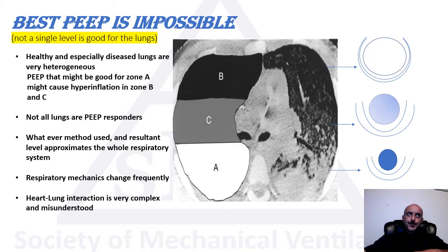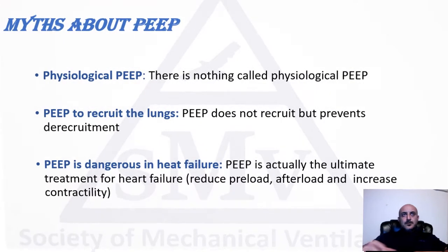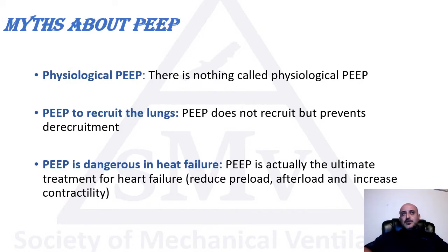So let's talk about some myths about PEEP. I hear sometimes about physiologic PEEP, and people say we'll apply PEEP to match the physiologic PEEP. Of course, there's nothing called physiologic PEEP in a normal healthy person, otherwise it would be called auto-PEEP, basically an obstructive lung disease.